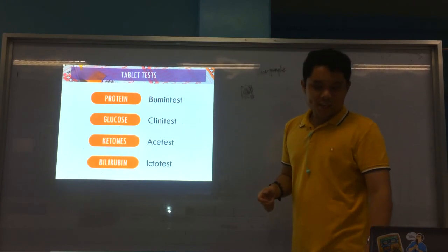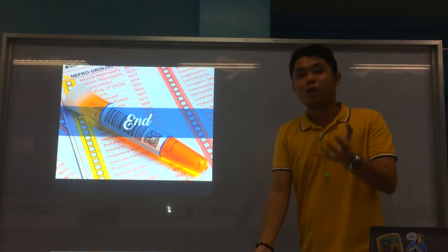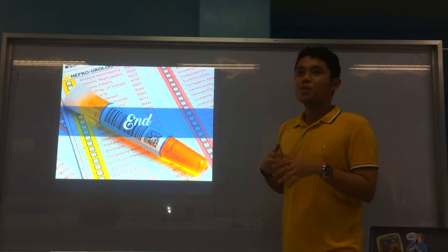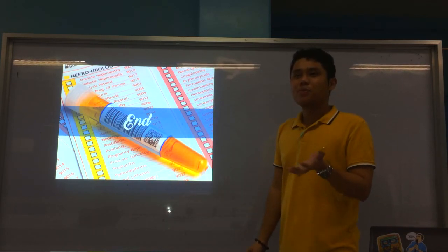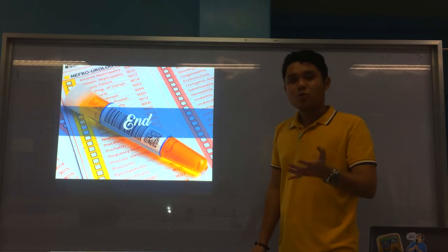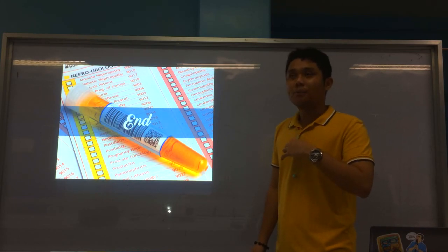Okay, alright. So basically, that's it for your classical chemical exam. Again, we perform these tests to confirm. So, you used a reagent strip and saw positive for protein or glucose, and you want to confirm if it is true, then you can test this classical chemical exam. But again, this is not usually performed, as I've experienced in the routine lab, because it's time-consuming, you need a lot of reagents and specimens, so they rely on reagent strips instead.